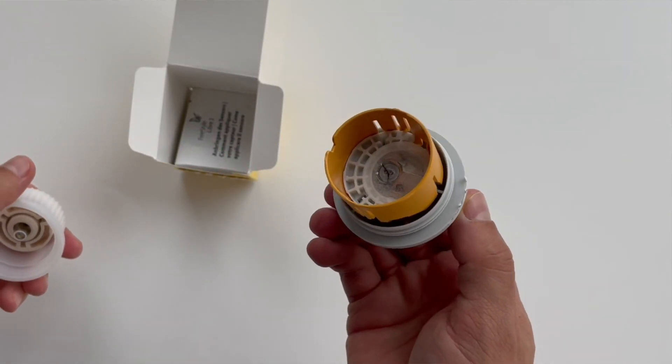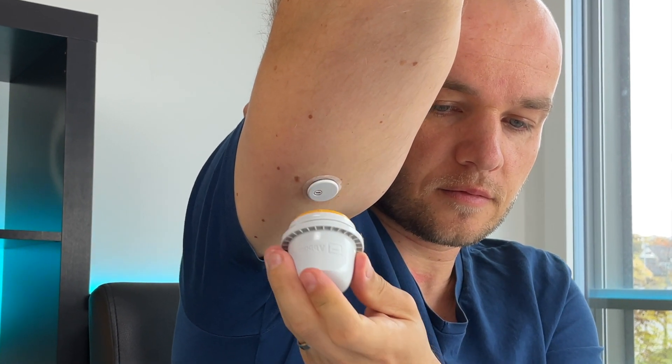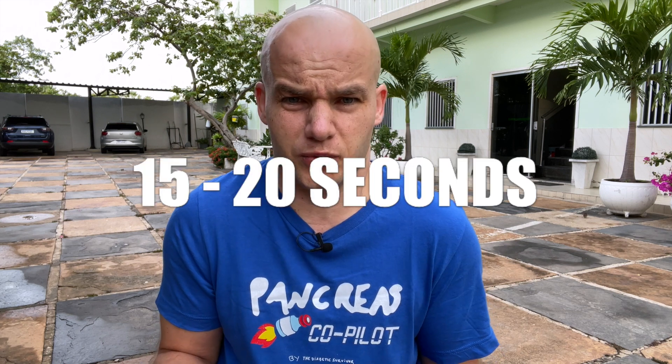All you need to do is clean your skin, screw off the lid of the applicator, and push the applicator against the skin, then scan the sensor with your phone — and this is the only time you need to scan, by the way. There is no more scanning after that. So I think Freestyle Libre 3 application could really not get any easier. There is literally nothing you can mess up and it takes literally 15 to 20 seconds.